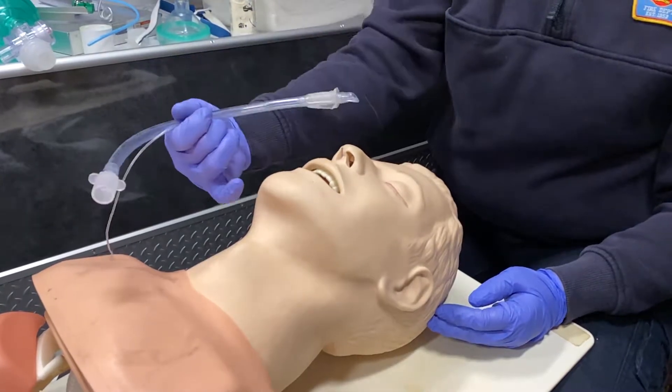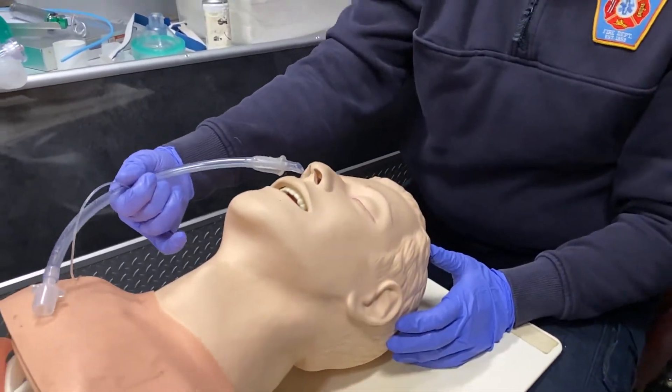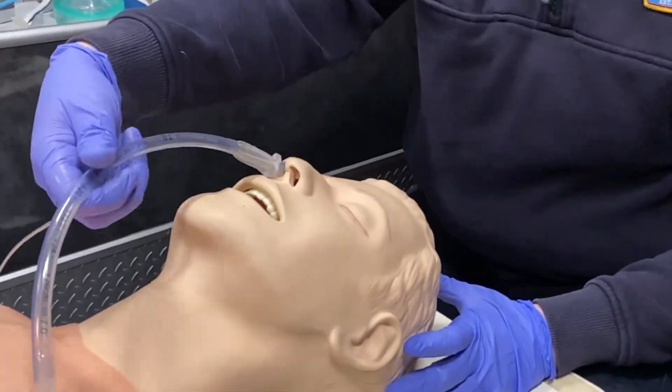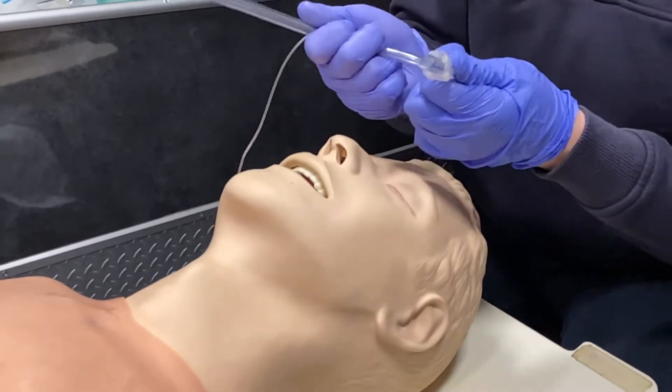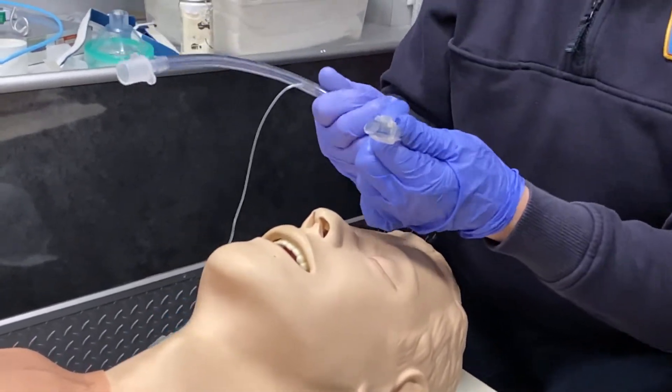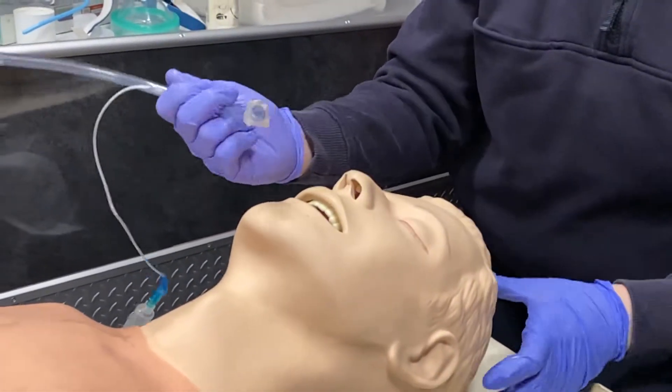We're going to introduce the tube. Typically we try to use the right nostril, but you can use either side. The reason the right nostril is easier is that we want the bevel of the ET tube sitting in that nostril. I like to bend my tube a little bit to give it some flex so it goes in easier, and make sure you lube the distal end of your tube.